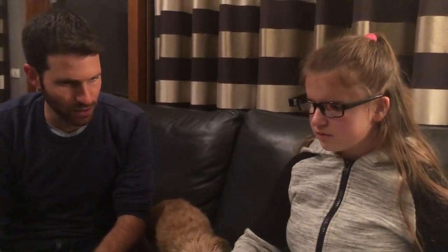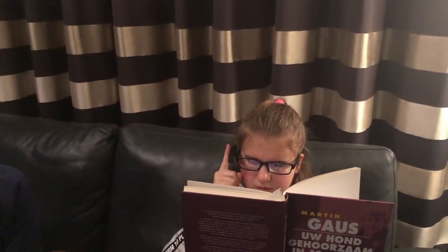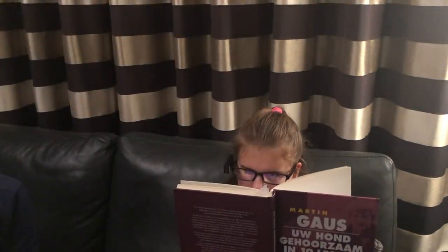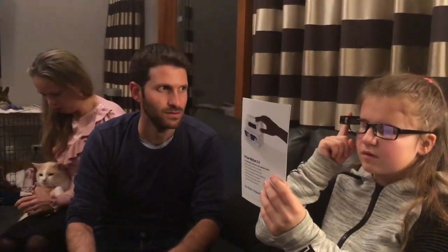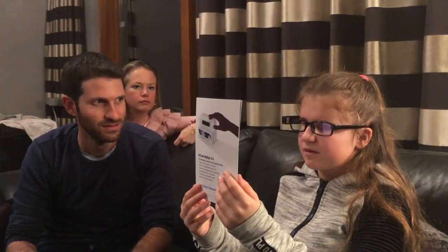Here is the book — it's your book and you can open whatever page you want. Hold it in front of the camera, and if you want to read the whole page you can use the activation bar. Oh — the device automatically switches from English to Dutch and from Dutch to English, exactly in front of you. Very good!